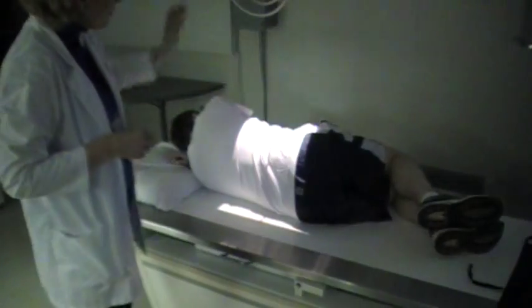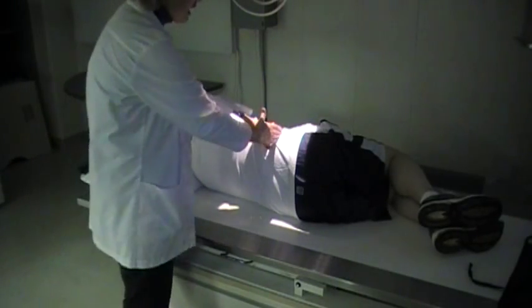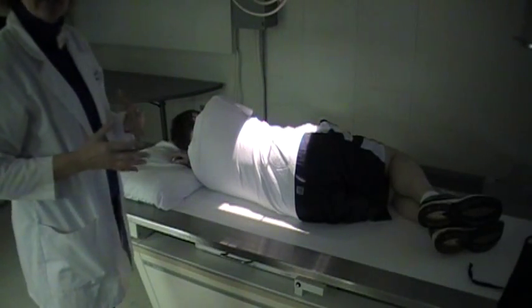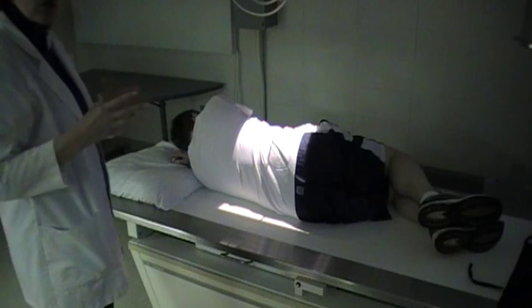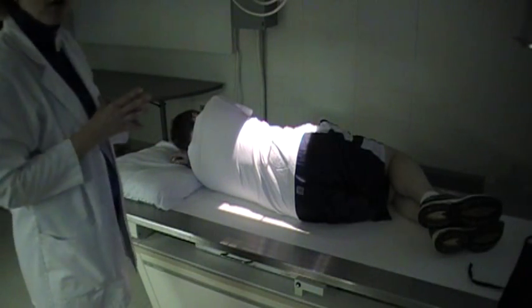For the lumbar, I'm going to center right at the crest, because oftentimes a lot of surgeries are done at the L4 or L5 level. When you center directly on the crest, that gets more of the sacral portion and the lower portion of the lumbar — it gets zeroed in right over that area.